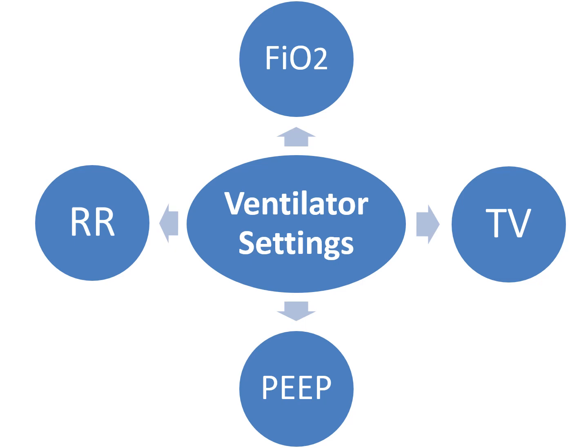With PEEP, if you maintain just a little bit of PEEP or different levels of PEEP, if you keep the airways open just a little bit, the next breath is a lot easier to open those alveoli. It kind of gently nudges them open, and keeping them open also helps with recruitment of alveoli that are not affected by acute lung injury or ARDS, so that it will utilize the good lung tissue to be open longer and promote more diffusion of your O2 and CO2. Your typical settings for PEEP are 5 to 10, but it can increase to settings as high as 20 centimeters of water in patients that have acute lung injury or ARDS.